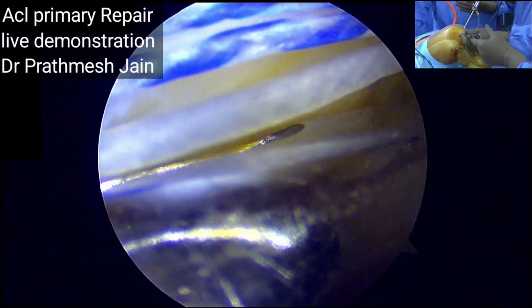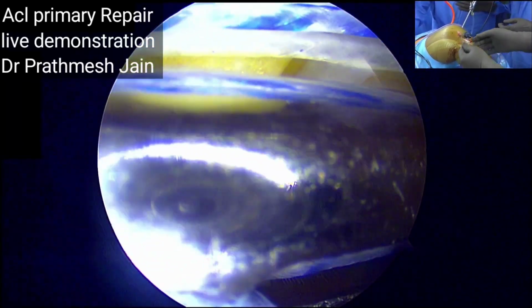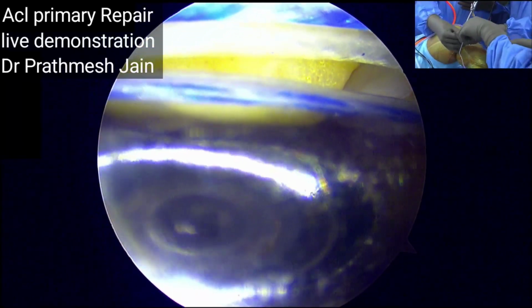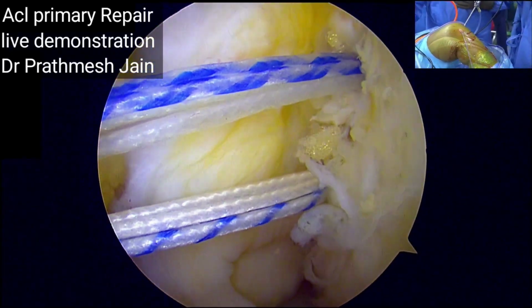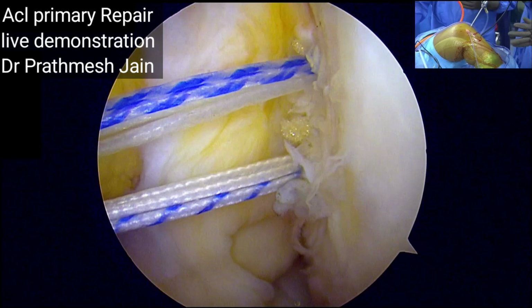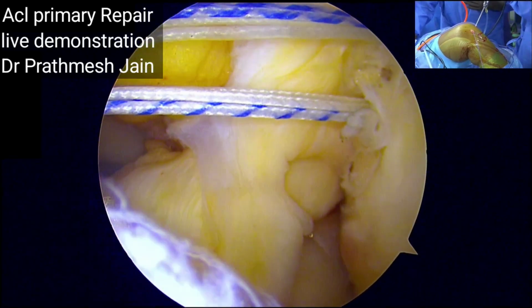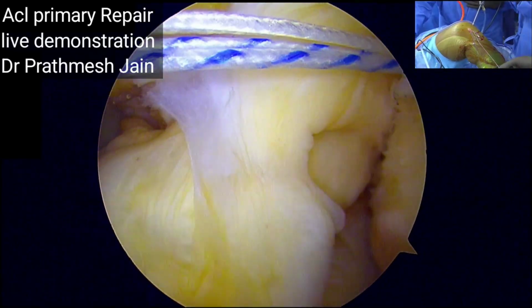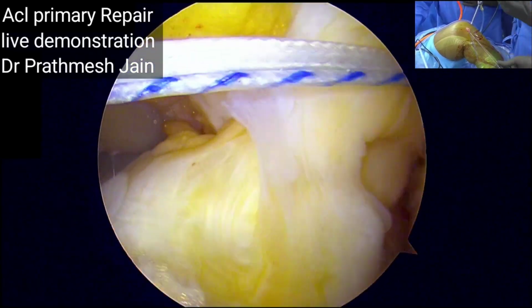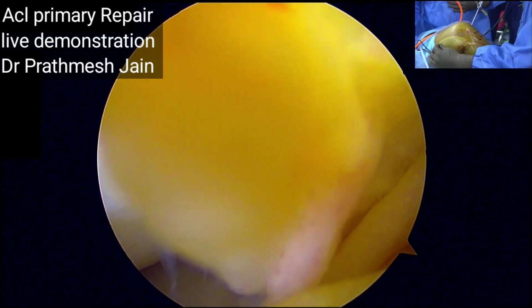So in this case, we want a primary healing. That is why we have done a small microfracture at the portion of the footprint per se, and then we have done two anchors specifically in the area of the resident's ridge, because the attachment of the ACL will be posterior to the ridge. Now what we can see is actually the ACL is folded outside, and we need to take it back into its place.